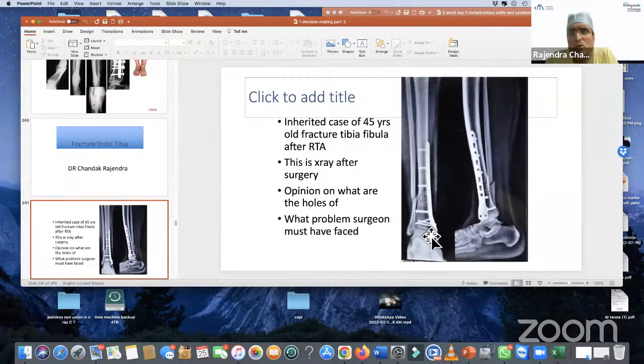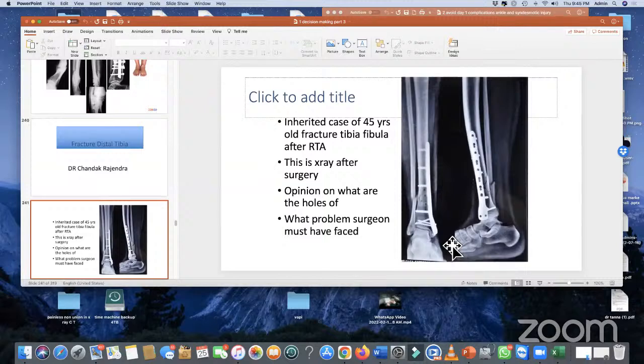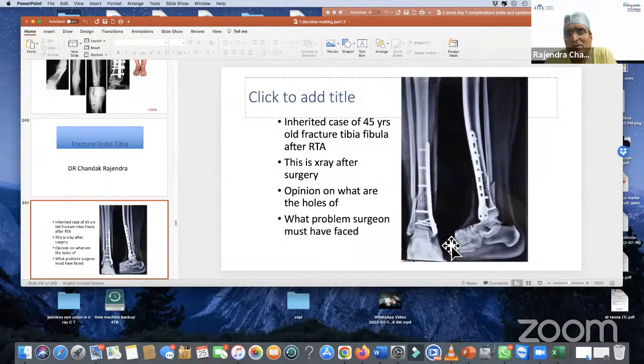What you can do is, the aim of fibula fixation is to neutralize the ankle valgus and to get a tibia reduction very nicely. So when you do a fibula reduction, usually that is first. You may put a plate, span it proximal and distal, put two screws, and complete the fixation of the tibia. In case you feel that the fibular fixation has given way or there is some issue, then you can revise that and lock it back. But I would always do a fibula fixation first.